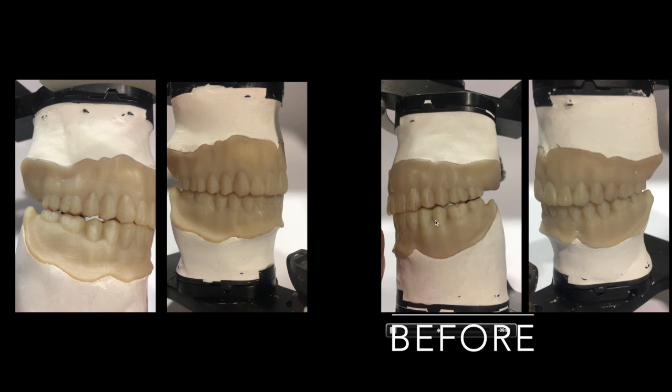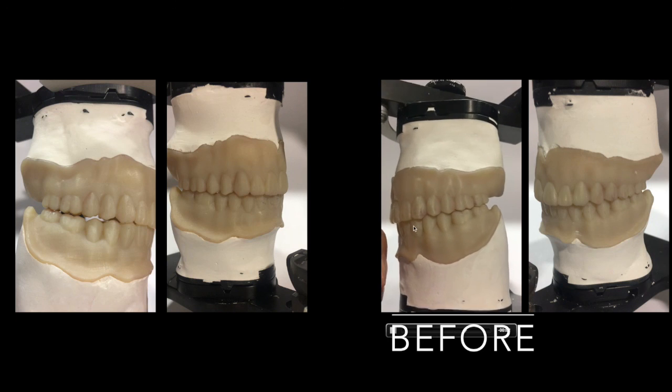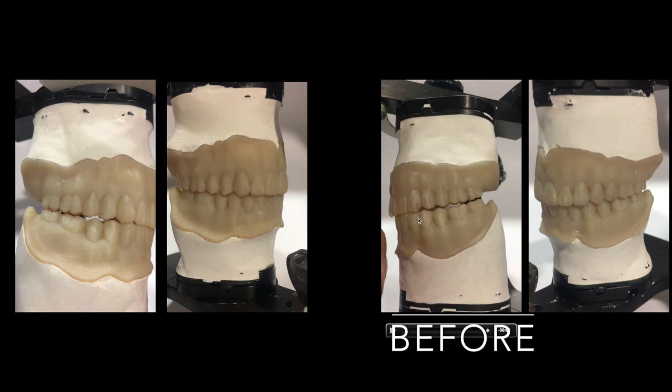And this is the other side. The same thing happened on the working side. Only the canine is touching, none of the posteriors, meaning right now the denture has canine rise, canine guidance. So you need to adjust starting from the canine until all four teeth are in simultaneous group function contact.